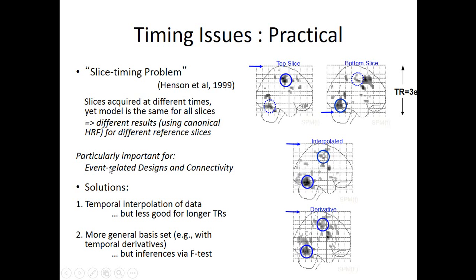It's particularly important for event-related designs where timing becomes important. For block designs, it's not such a big deal because the timing differences we're talking about are sub-TR, so less than 2 seconds generally, maybe 1 second difference in timing. So that's not really a huge problem.